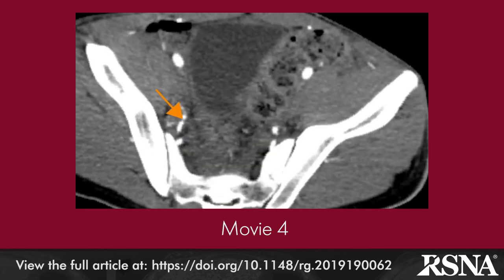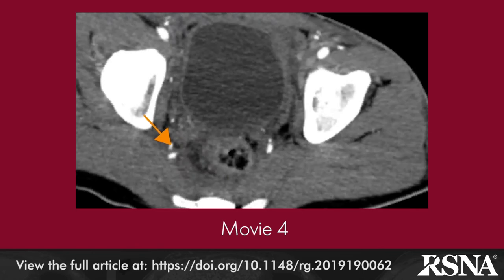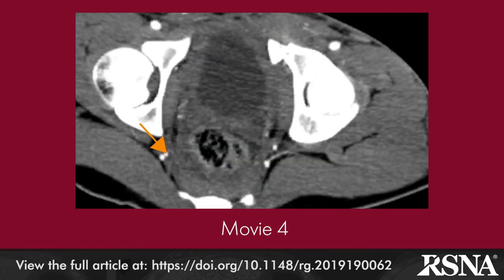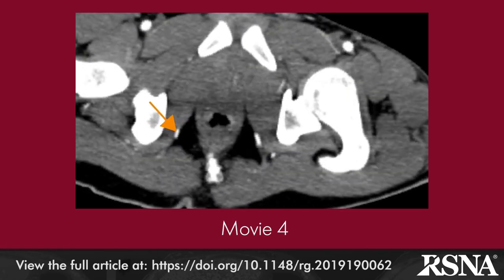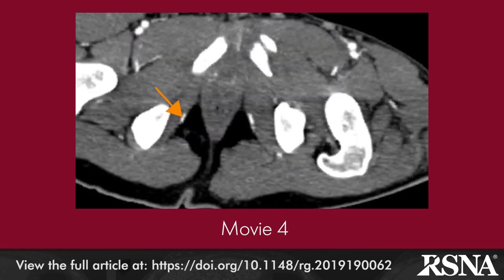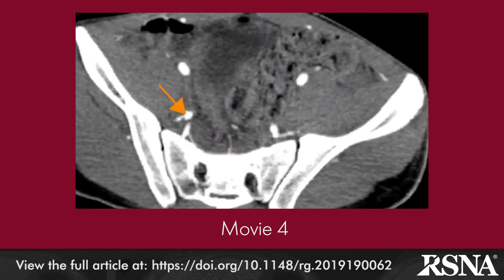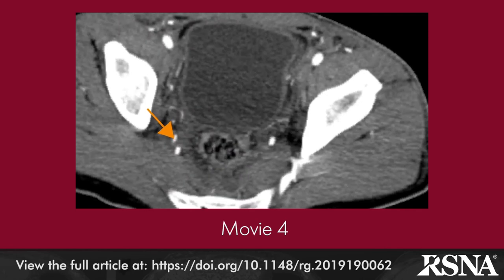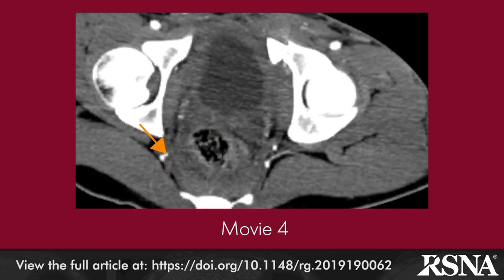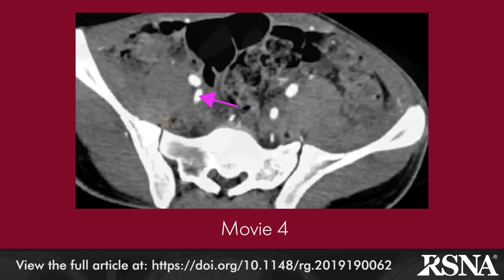Movie 4 illustrates the internal pudendal artery. An axial maximum intensity projection pelvic CT in the craniocaudal direction in a 31-year-old man shows a colored arrow following the course of the artery on the right side, arising from the anterior division of the internal iliac artery. The vessel travels in a downward and outward trajectory, remains anterior to the inferior gluteal artery, exits the pelvis through the greater sciatic foramen beneath the piriformis, then curls back by sweeping around the sacrospinous ligament into the pelvis.